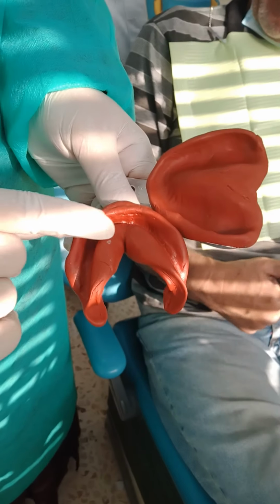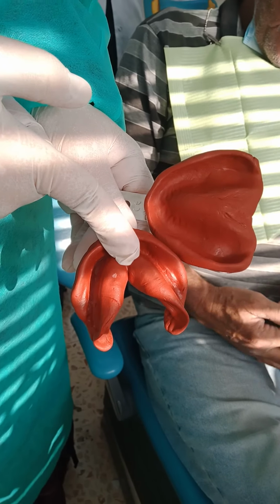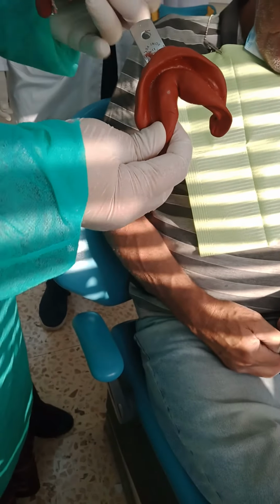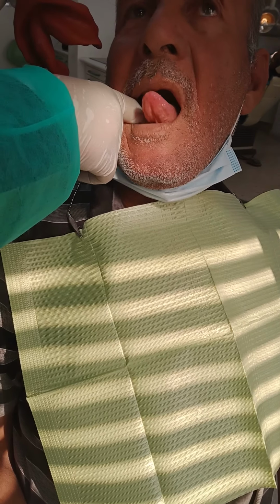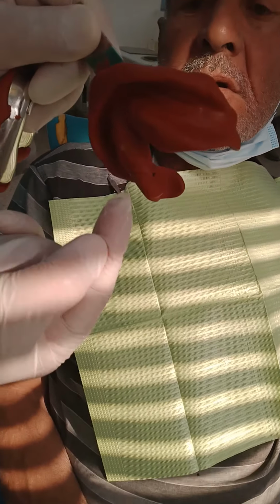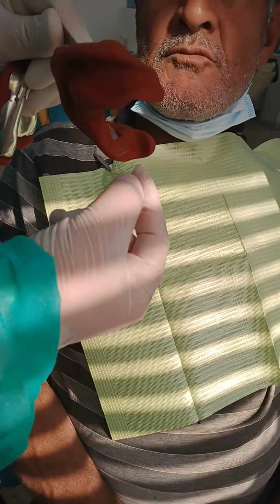But what I want to concentrate on in the lower is the S shape. You can find that the lingual pouch is deeper than the lingual frenum area. When I take a measurement from inside the patient's mouth, I put my finger on the retromolar pad, then I go down, with the tongue on the upper lip. I note how much my finger entered, and then I compare it with the same side. So there is no shortness. If it was short, I would need to add material.